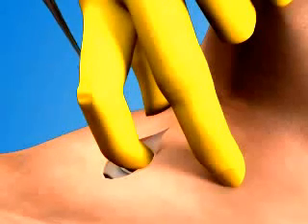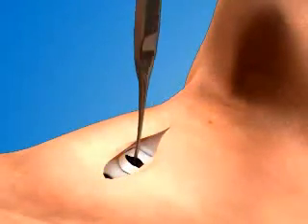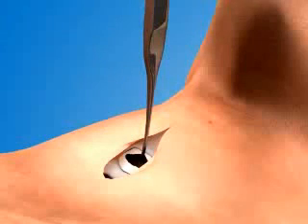Next, place the tracheal hook into the opening in the membrane. Rotate the hook cephalad and pull it gently toward the ceiling to snare the inferior aspect of the thyroid cartilage.